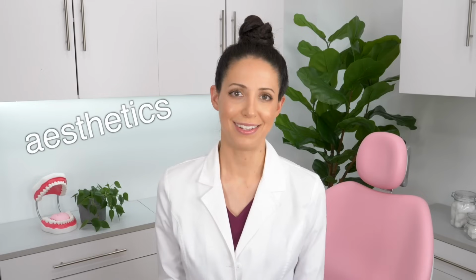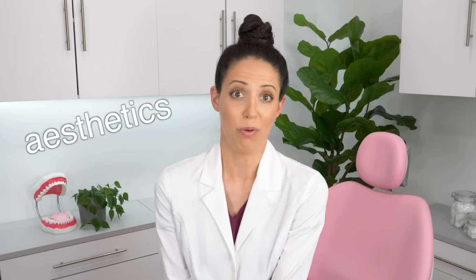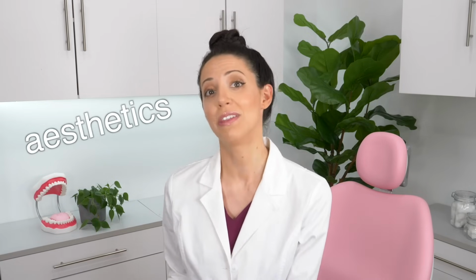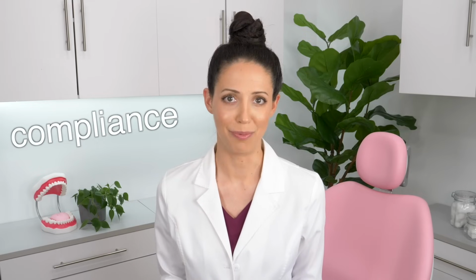For aesthetics, decide what your expectations are going to be before starting braces or clear aligners. Are you self-conscious about getting traditional braces, having a mouthful of metal, or are you aware of the time commitment of clear aligners versus braces? Do you have a deadline when you are hoping to be finished? Things like that. Next, for compliance, consider your maturity level relating to compliance.